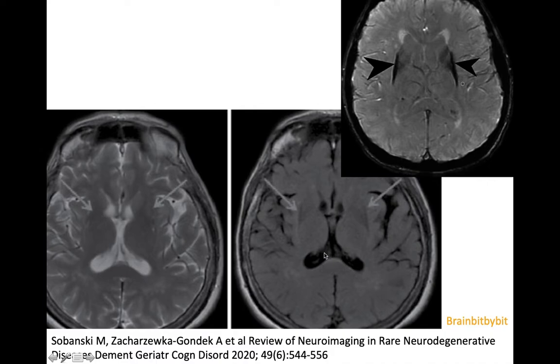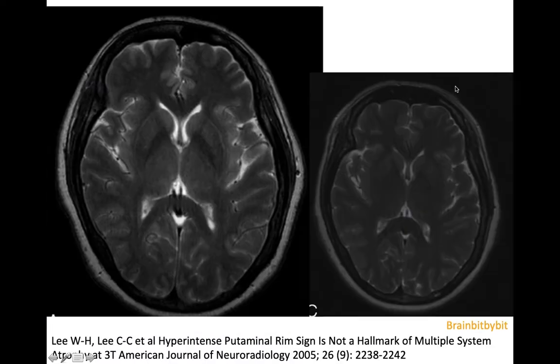This hyperintense putamenal rim, of which this is another example, is often described in the literature. And also the iron deposition, which is better visible on susceptibility-weighted images. But the hyperintense putamenal rim is not exclusive for multi-system atrophy when it comes to a 3 Tesla scan.